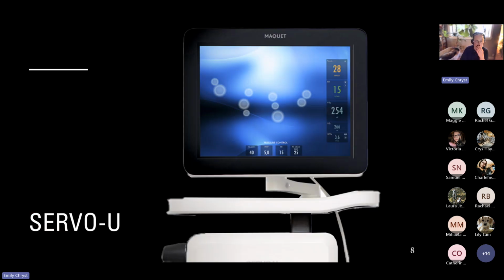And one of the big things about it is that in the human world, they do all the studies, right? They've got all the money for all the studies. This ventilator was studied specifically in the frame of safety for teams that don't ventilate often, and was found to be one of the safest ventilators, because it basically tells you everything that you need to do, including alarm troubleshooting, which is great.